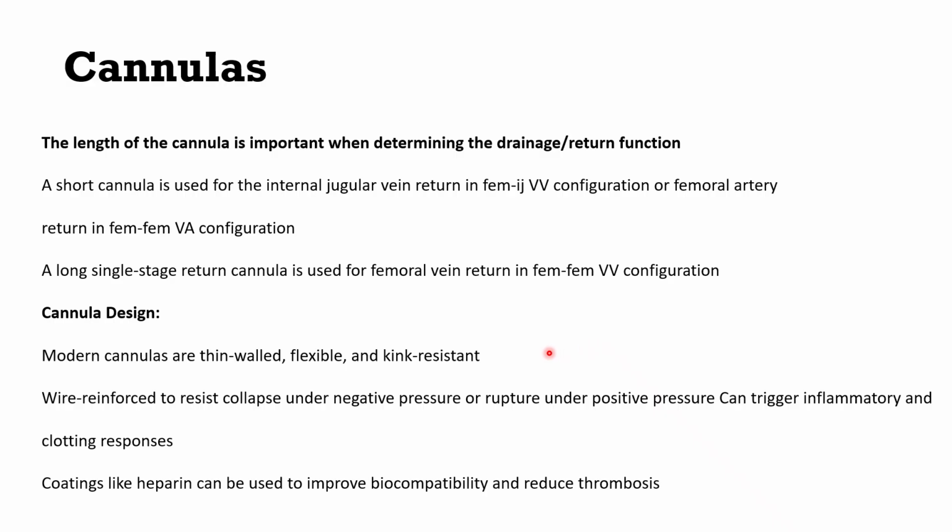Modern cannulas are thin-walled, flexible, and kink resistant. They are wire reinforced to resist collapse under negative pressure or rupture under positive pressure, but they can trigger an inflammatory and clotting response. Coating like heparin can be used to improve biocompatibility and reduce thrombosis.